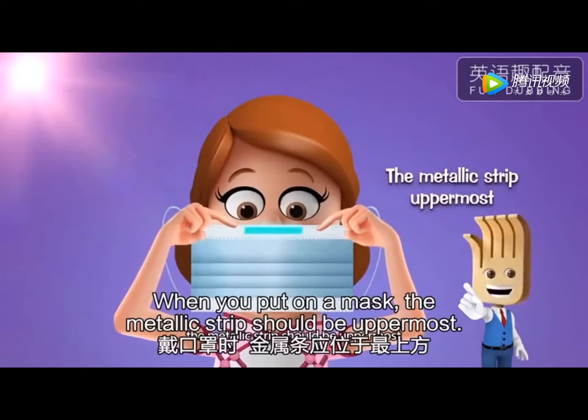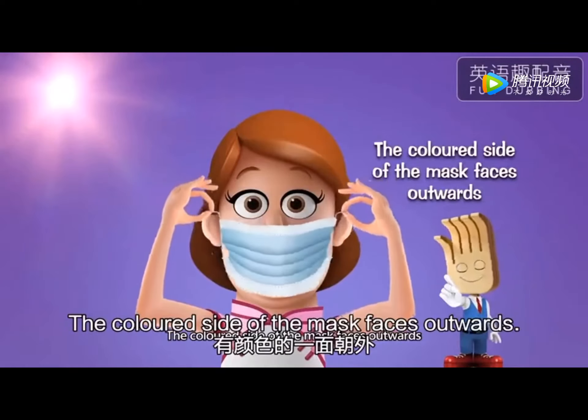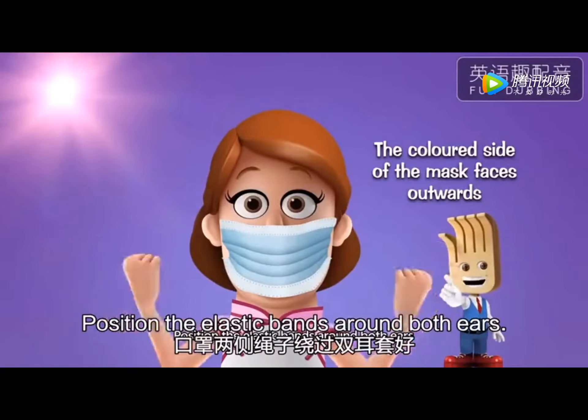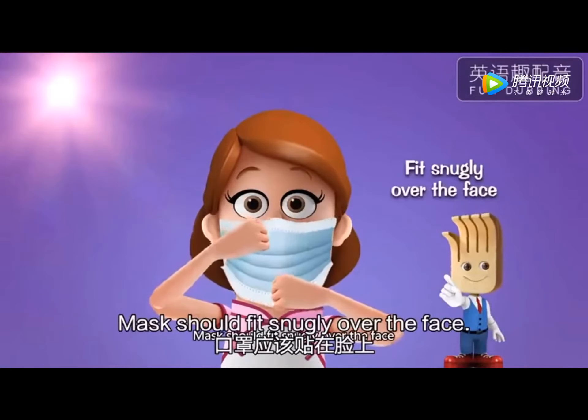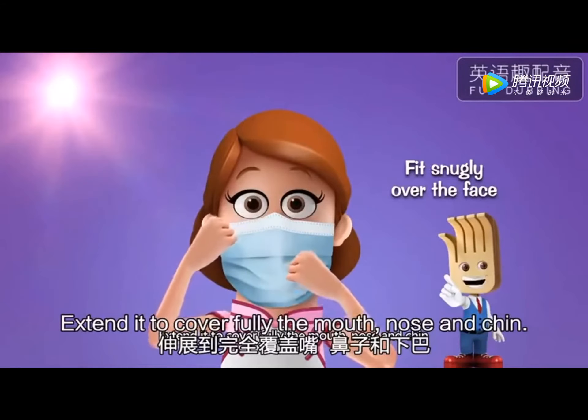When you put on a mask, the metallic strip should be uppermost. The colored side of the mask faces outwards. Position elastic bands around both ears. The mask should be snug over the face. Extend it to cover fully the mouth, nose and chin.